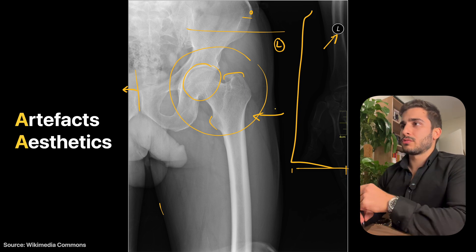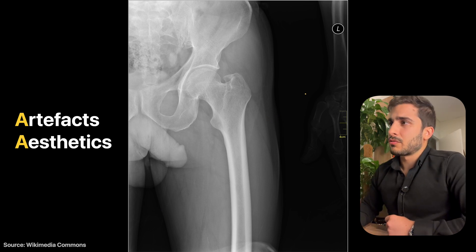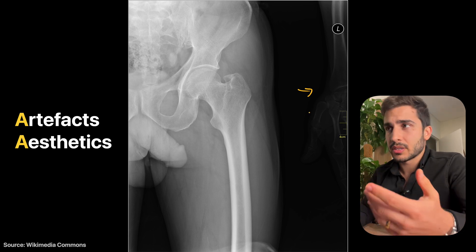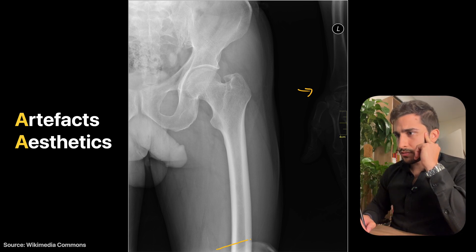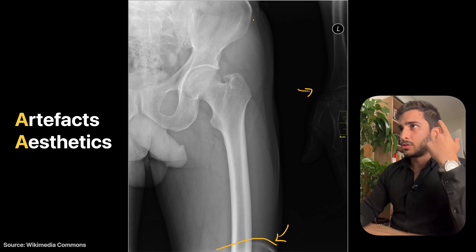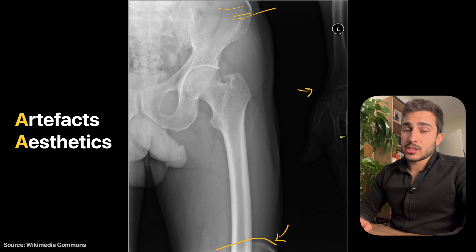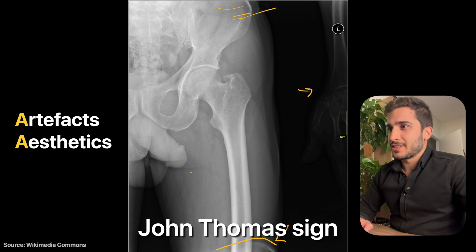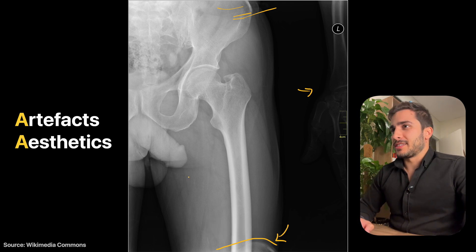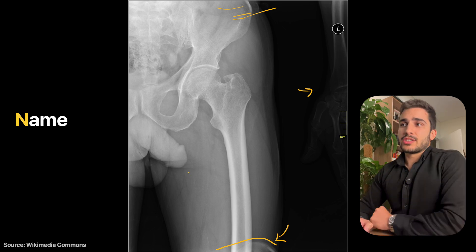In terms of aesthetics and artifacts: the hand in frame isn't an artifact per se, just something that shouldn't have been x-rayed. There's a faint line of uncertain origin — possibly an artifact. Some slight lines near the top may be the patient's underwear. In the middle you have the soft tissue genitalia sign — sometimes called the 'John Thomas sign.' Otherwise aesthetics are okay. No name or identification is visible for anonymous reasons.